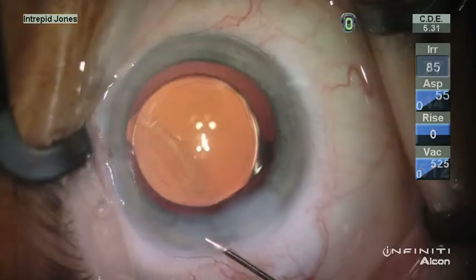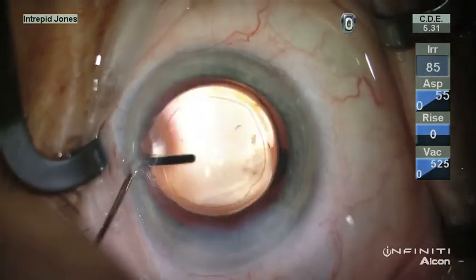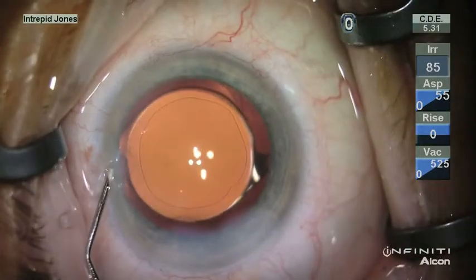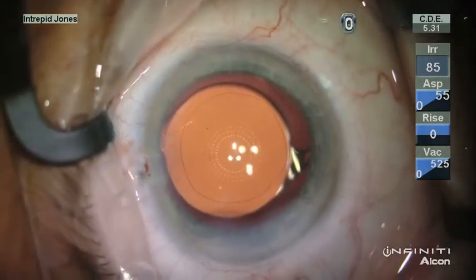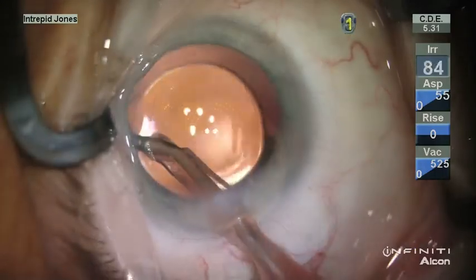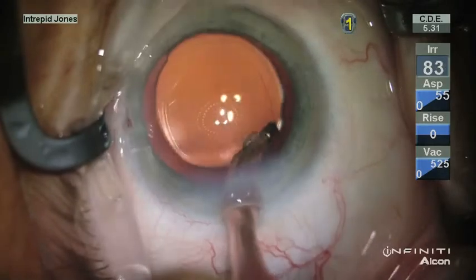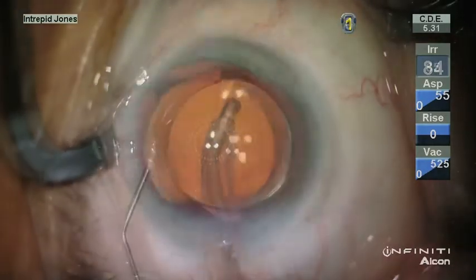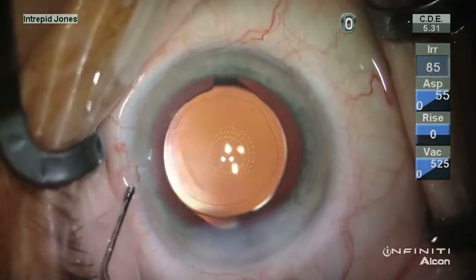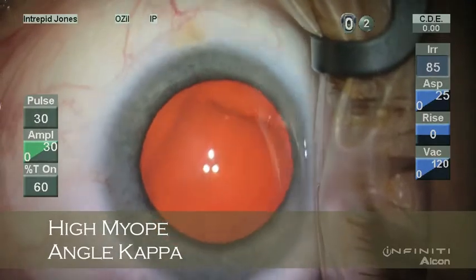In this case, once the lens is in place and the viscoelastic is removed, it's noticed here as the anterior chamber is inflated, this lens does not really want to center that well. By rotating the lens into a more central configuration, we obtain excellent centration, and this is confirmed with the keratoscope.